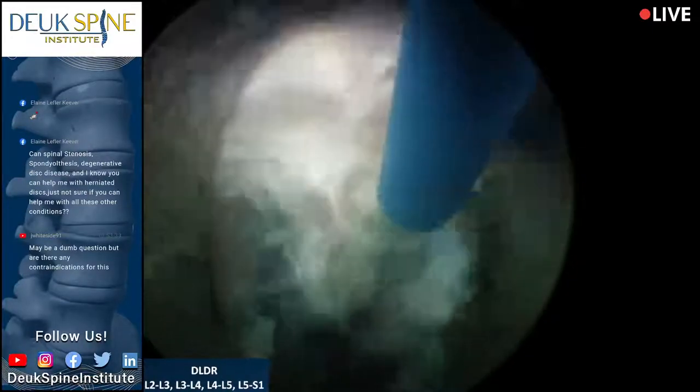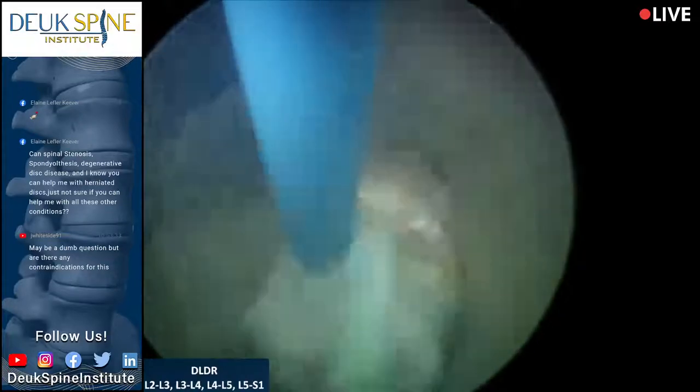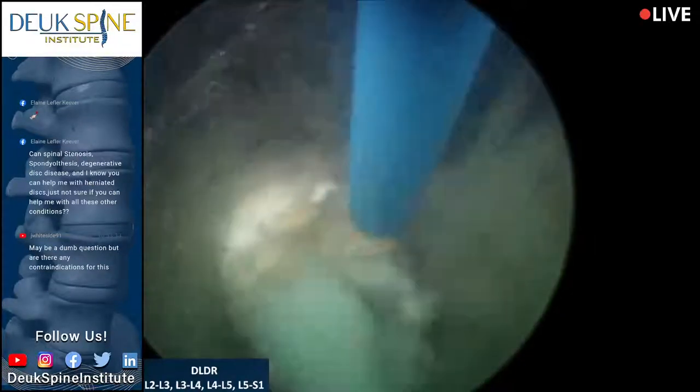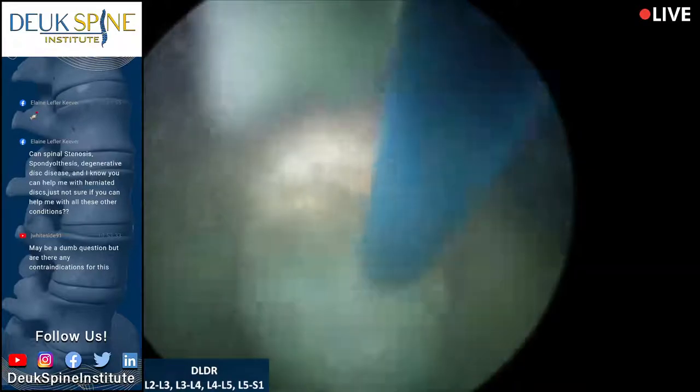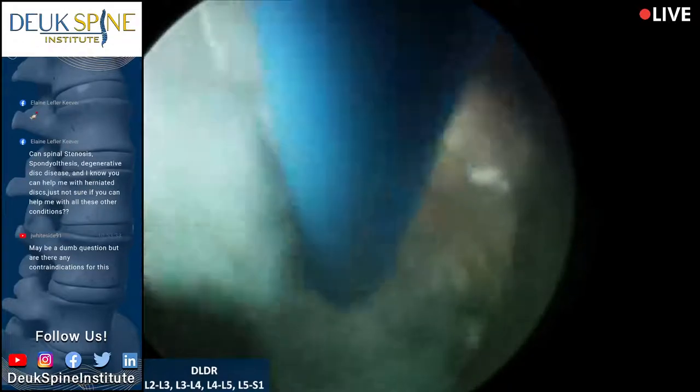You ready? All right. You guys are doing all right? Thank you. This will be a pretty quick one. I don't see much more herniation in it. Just the annular tear needs to be debrided. You guys can lighten them up a little if you want.